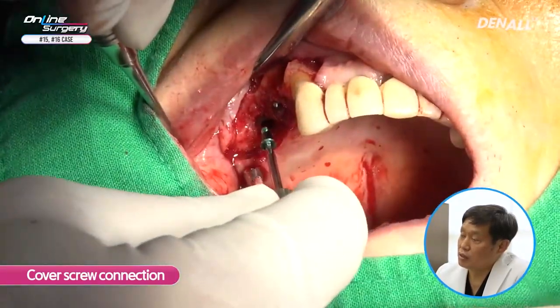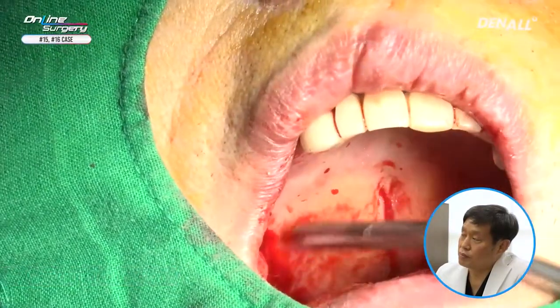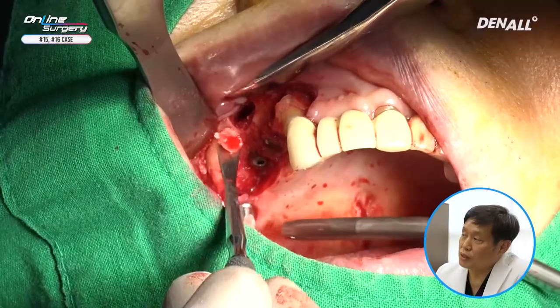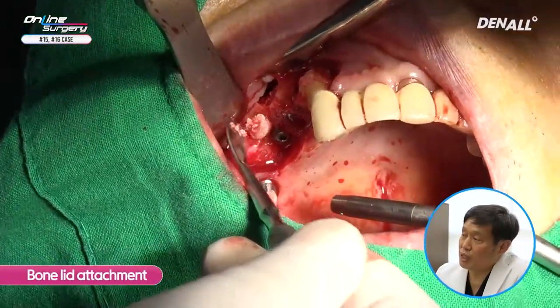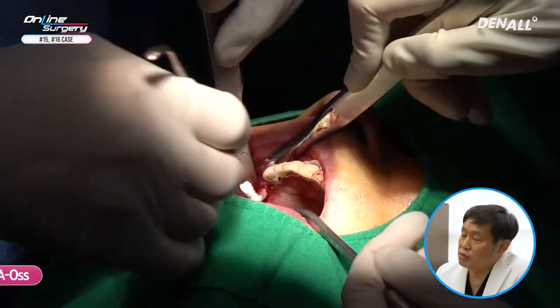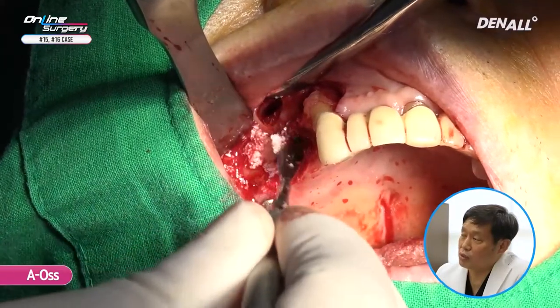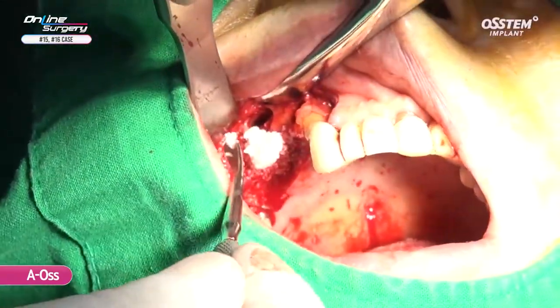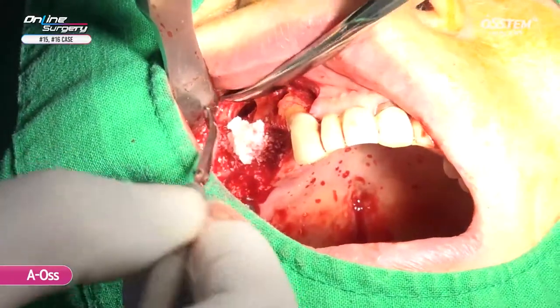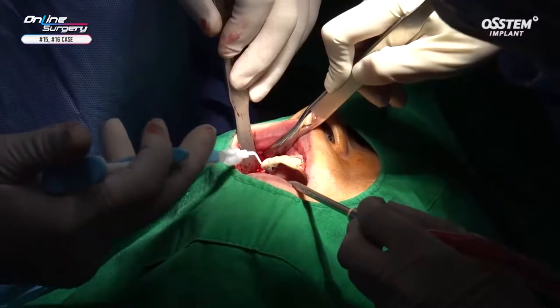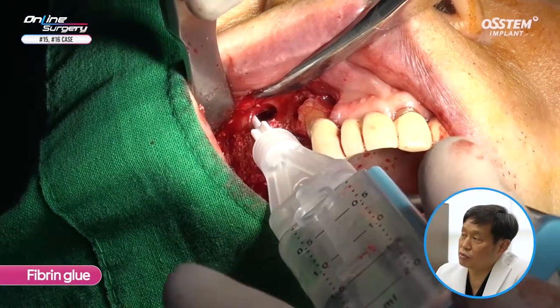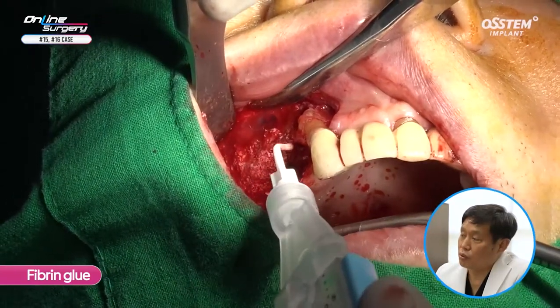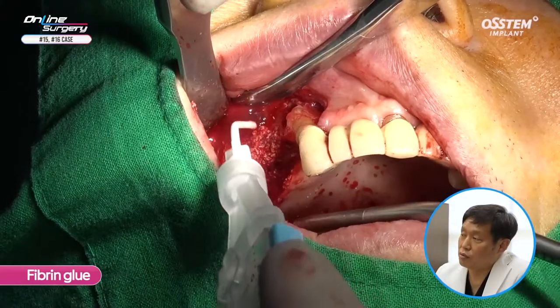Cover screw is connected. You can see the bone lid that was formed during the bony window. On the buccal side of number 16, because there's a buccal defect, it's going to be used like an autogenous bone block, and on top, I'm adding more A-Oss for bone graft. Because the membrane was perforated slightly, I'm using fibrin glue to repair the sinus. I'm also applying fibrin glue on top of the bone graft to fixate it.